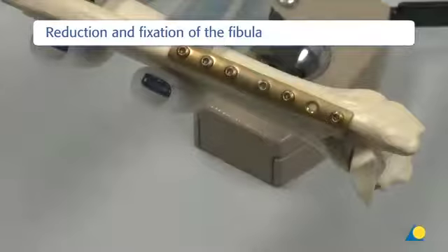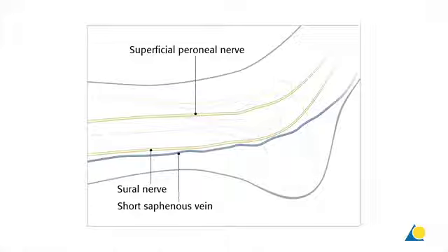The first step is the reduction and fixation of the fibula fracture. The standard approach is a longitudinal lateral incision. A 10 to 15 centimeter straight lateral incision is made in line with the fibula.